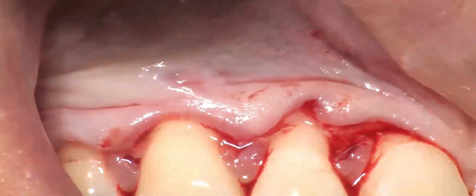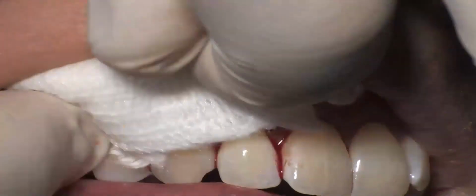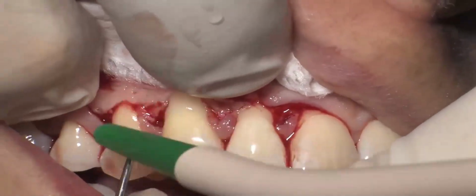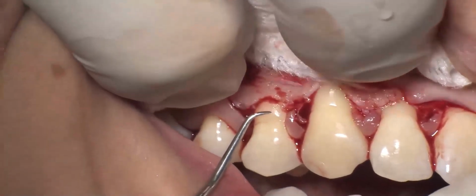Now we go to the premolar and change the gauze. You see that the bleeding is now really under control. And we start with the root planing of the premolar area.